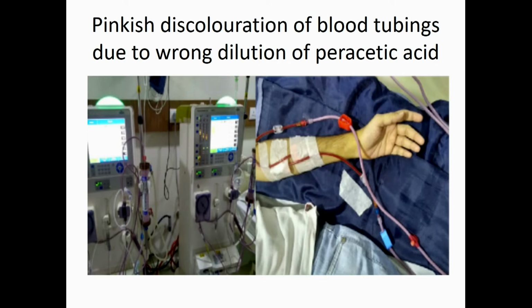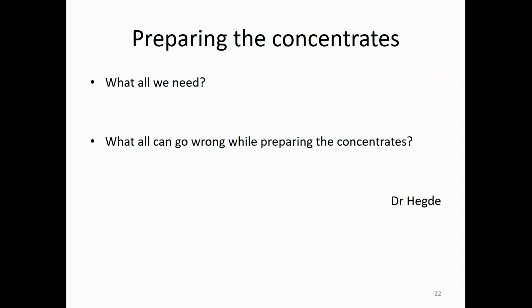So all in all, I think unless there is compulsion from Arogyashri or Rajiv Gandhi, for those 50 rupees, the saving is small. Ultimately, the best way to manage is to avoid reuse of tubing, and maybe reuse of dialyzer till today cannot be the norm. It has to be only in the people who cannot afford it.